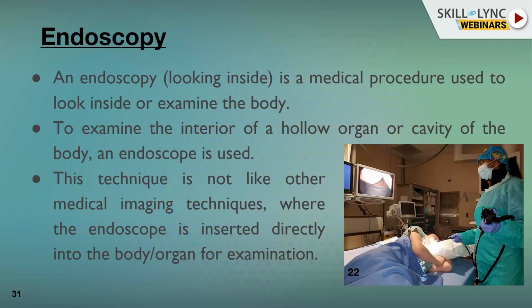and then what they'll do is, they'll see how the structure of the throat is looking. Okay, so that is for diagnostic purposes. It is not for treatment in the first place. The main application is to see what is wrong inside your body, in places where you can't actually go. So there we use something like a tube. That tube is nothing but made up of fiber optics.